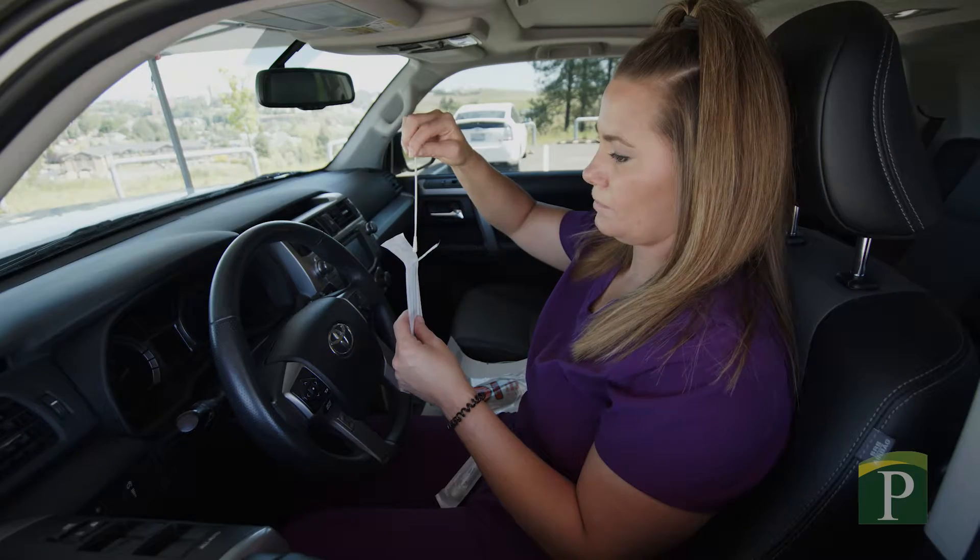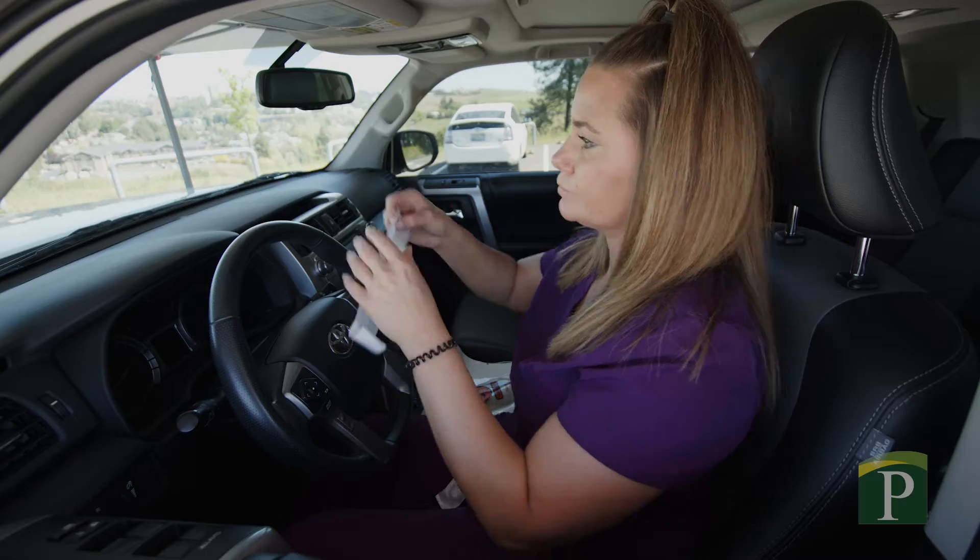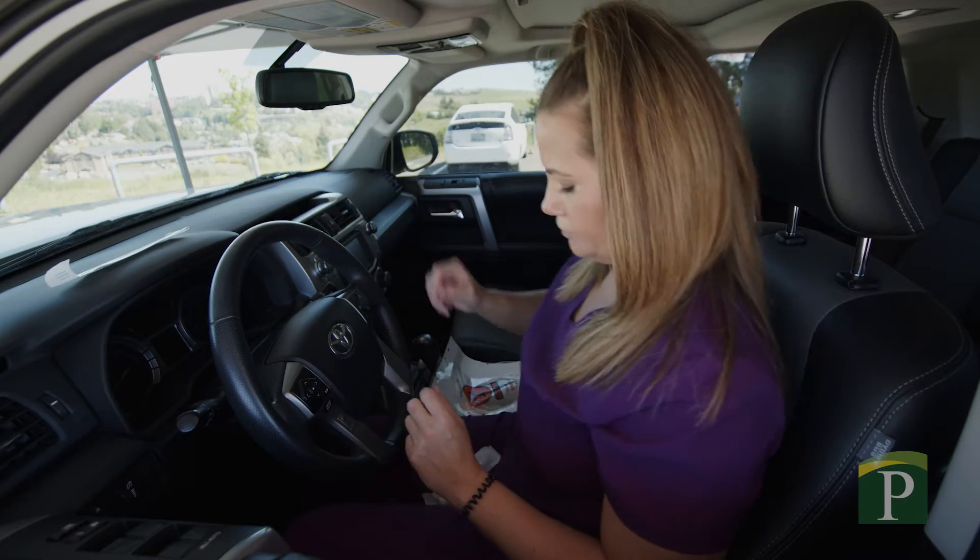Carefully return the swab to the plastic packaging, making sure not to touch anything along the way. This ensures it doesn't get contaminated through unwanted contact.